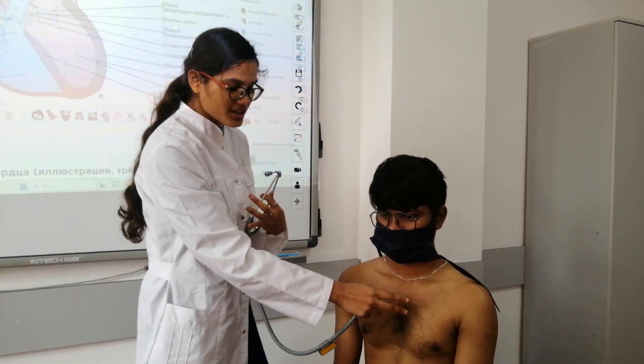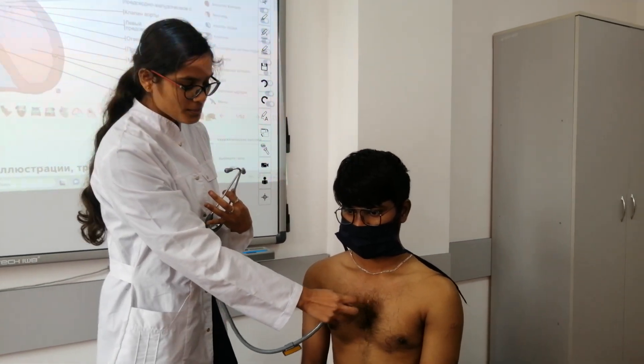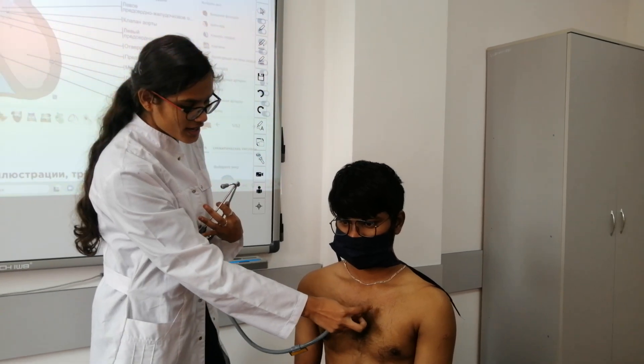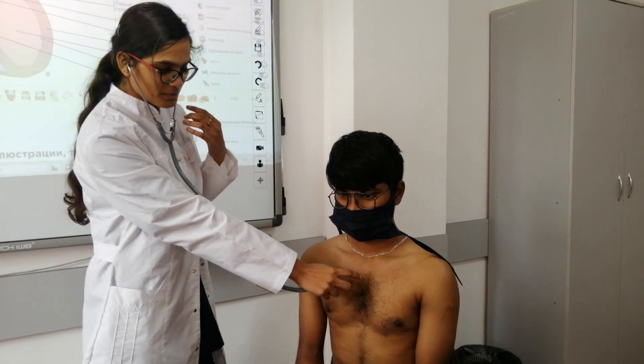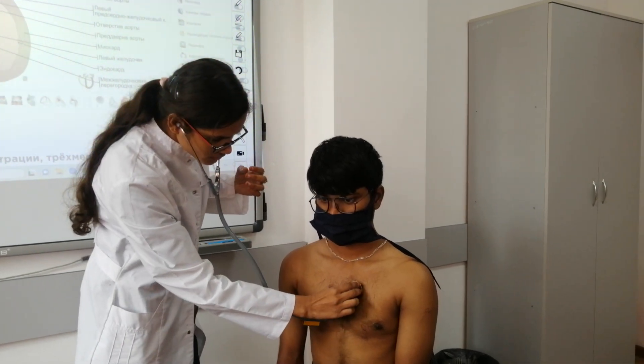Third auscultation point — the pulmonary valve. We are located at the second intercostal space, between the ribs near the sternum, to the left of the sternum. Yes, left of the sternum.